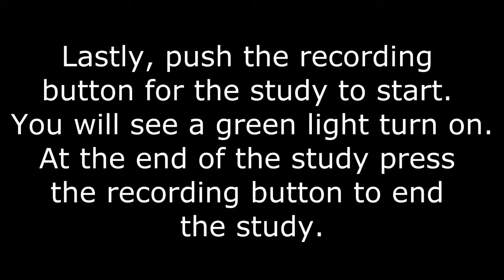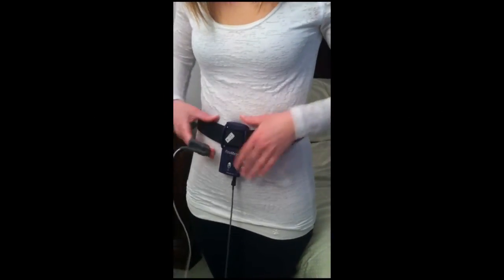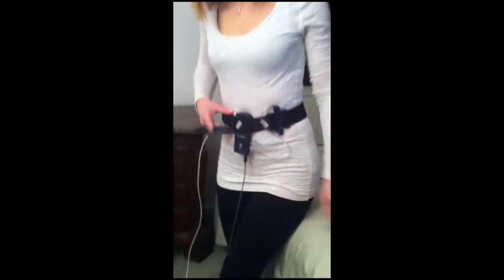You will see a green light turn on. At the end of the study, press the same button to end the recording. Now you're ready to go to bed. Thank you for choosing Private Sleep. Sweet dreams.